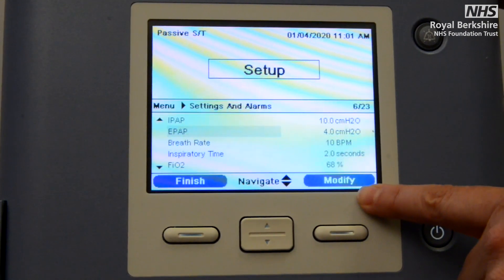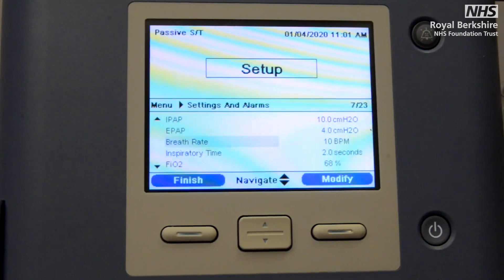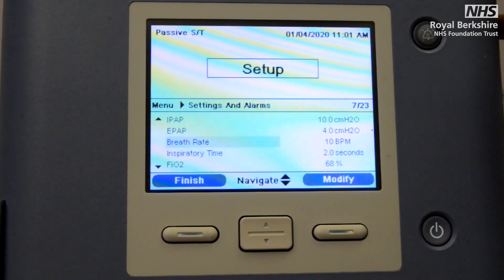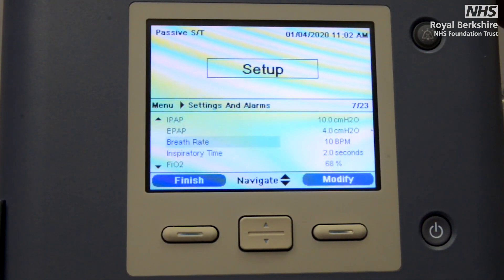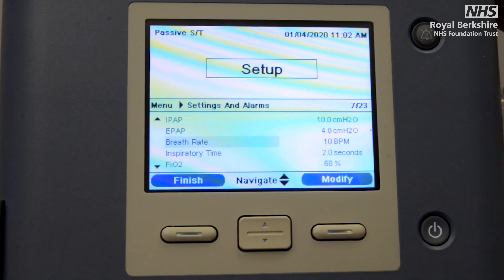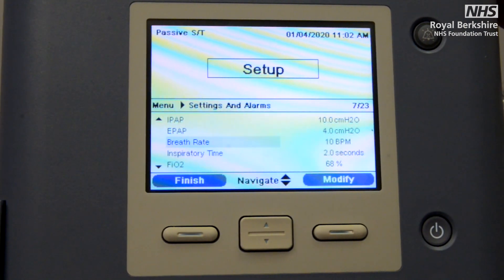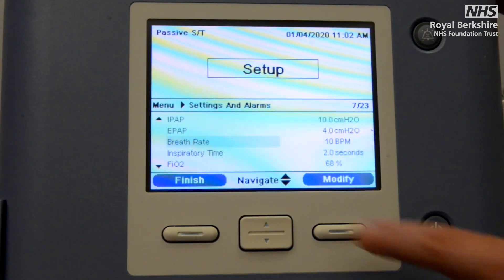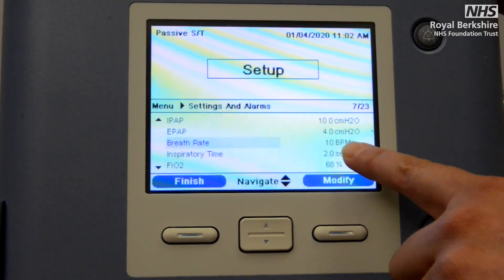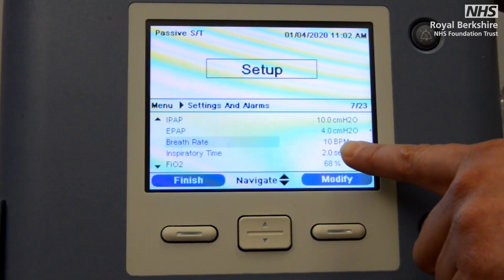Our EPAP, again according to policy, starts at 4 centimeters of water — so I do not need to modify this. Breath rate is a new setting we need to set, unlike CPAP. What we're saying here is: should the machine not sense that the patient is initiating any spontaneous breaths of their own, how many mandated breaths per minute would you like the machine to deliver? The safest setting for every patient here would be a minimum of 10 breaths per minute.